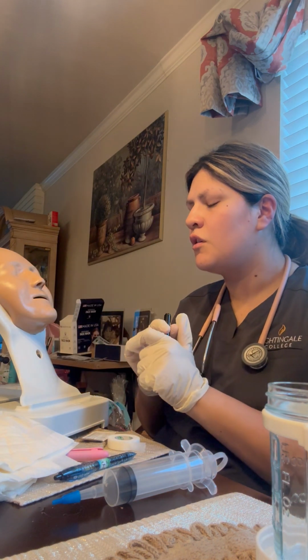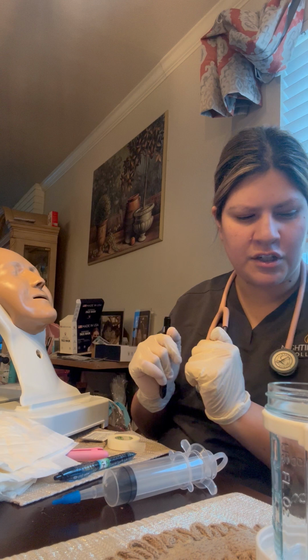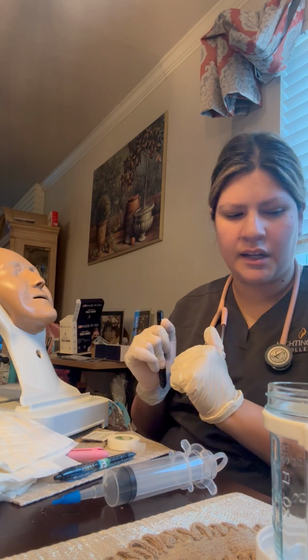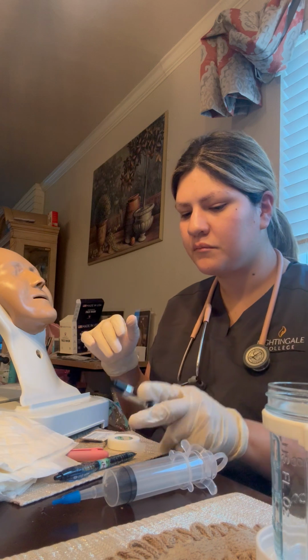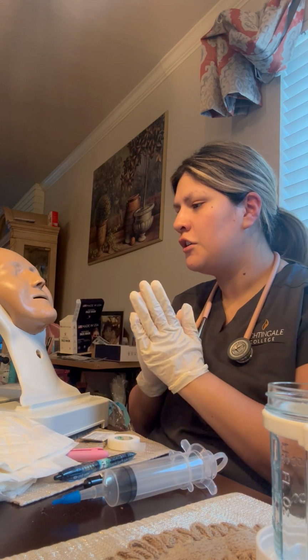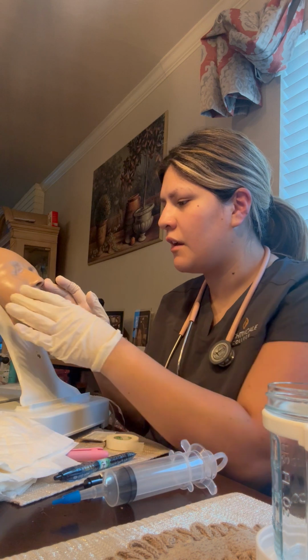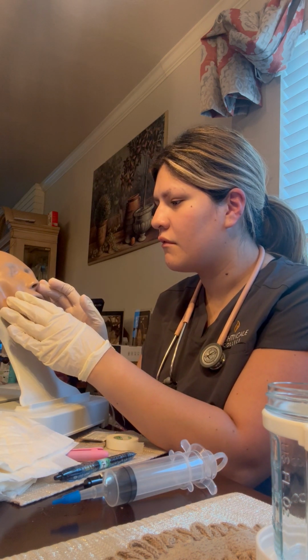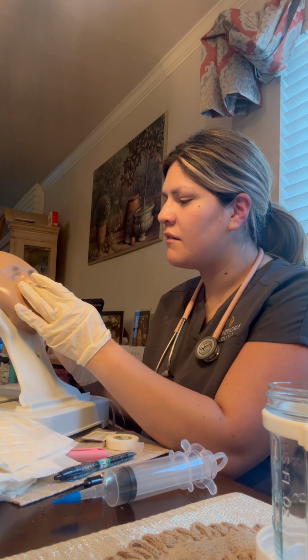Okay, so both sides are free from abrasions. There's nothing occluding it, nothing like that. The septum is midline. I'm going to go ahead and just press on one side of your nostril. Go ahead and breathe in and out. Okay. Breathe in and out on the other side.